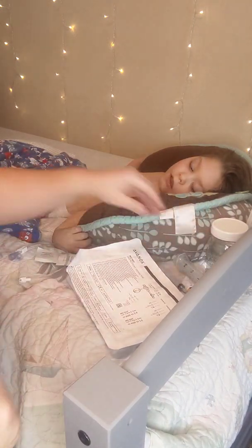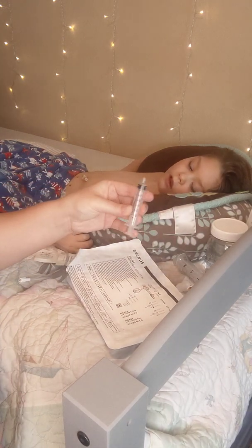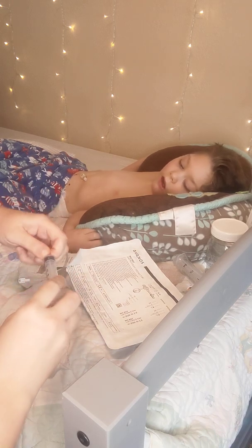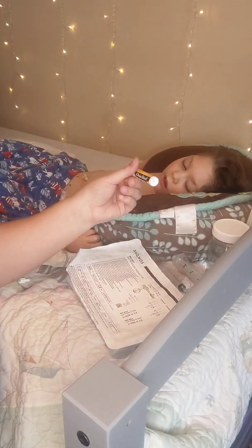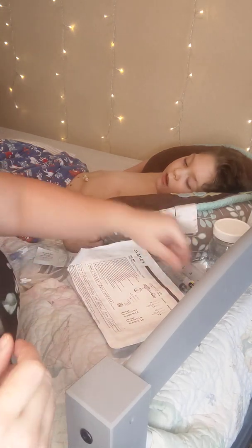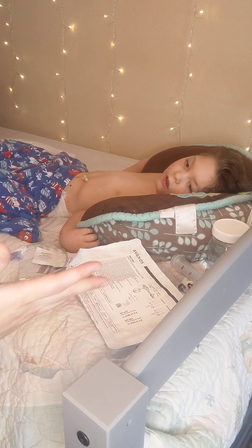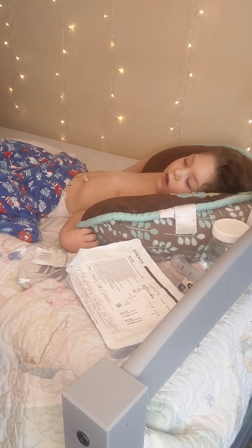Filtered water. I grab another, well, I guess you could use the one in here, but that's just to check to make sure everything's flowing through. And then I have a second 6 ml balloon syringe, and I'll show you why. Some kind of lubricant of your choice. I'm just going to use chapstick. You'll see, I'm just going to put a little bit around to help the new G-tube button in. And I think that's it. So let me get set up here.